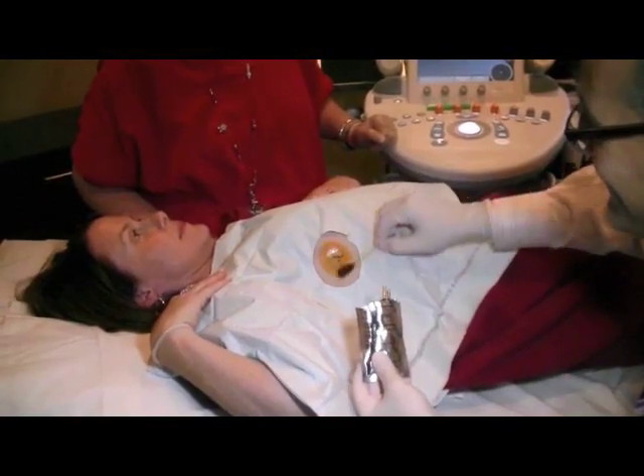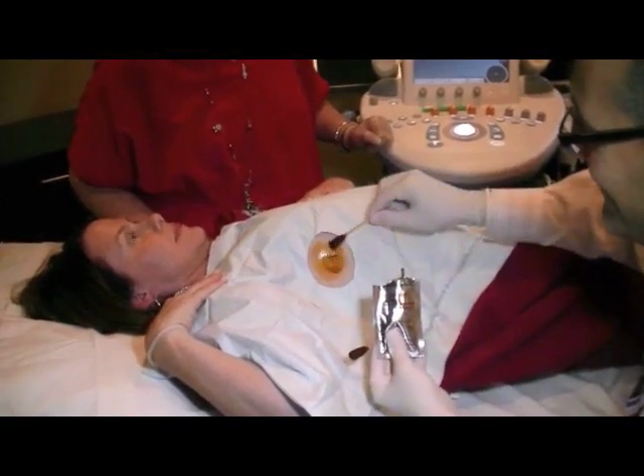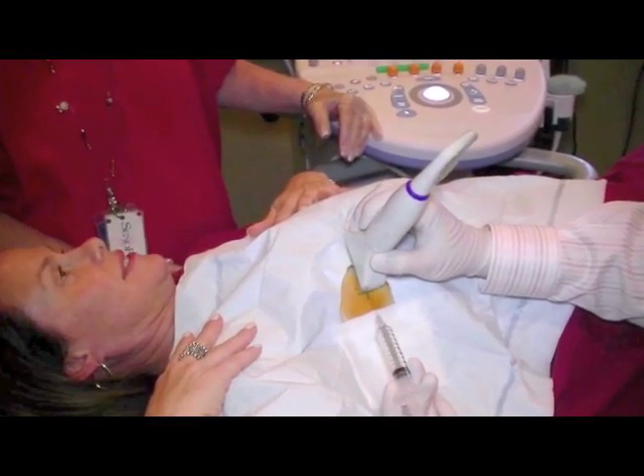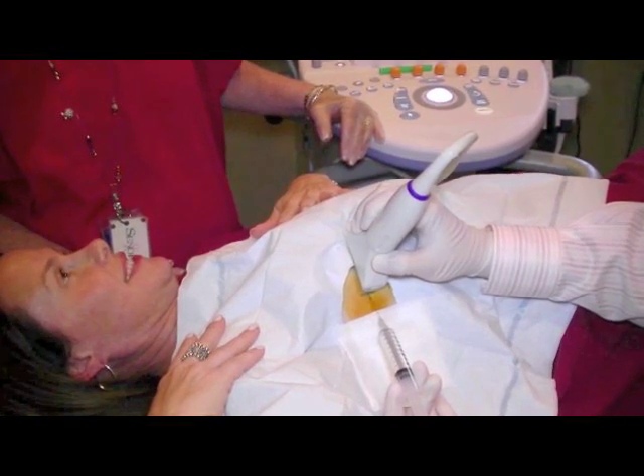The breast skin surface is then cleansed with betadine, a brown in color soap solution. Lidocaine, a medicine used for anesthesia, is then injected into the breast tissues in the region of the lesion to prevent or minimize any discomfort during the biopsy procedure using a small and very thin needle. Please let us know if you have any medication allergies.